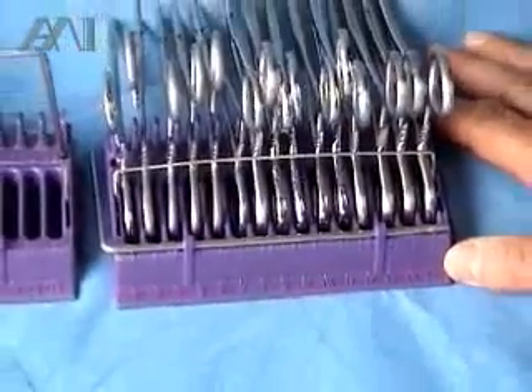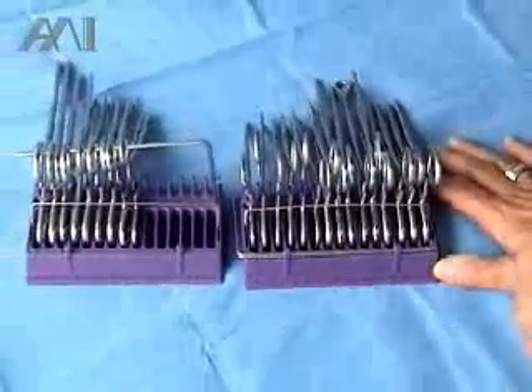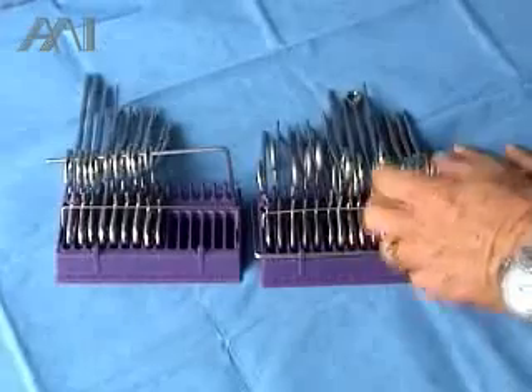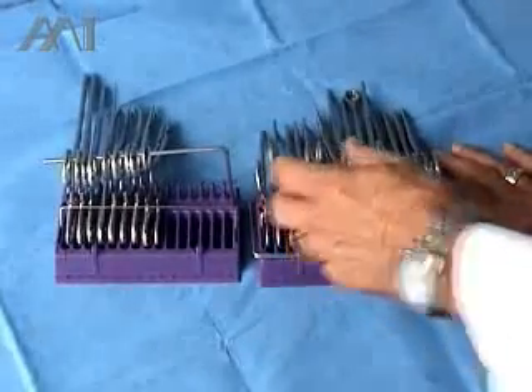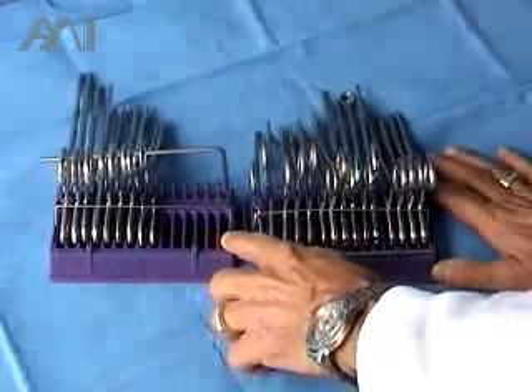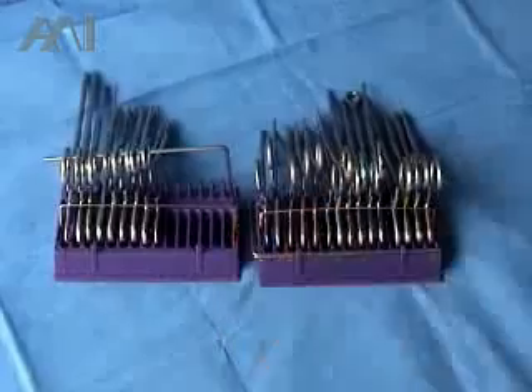This method meets the ARN-recommended standards for instrument counts. Instead of counting five Edson's, five Kelly's, five Mosquito's — which is time-consuming — you can actually look at the missing instruments in the slots and then look for them in the field.